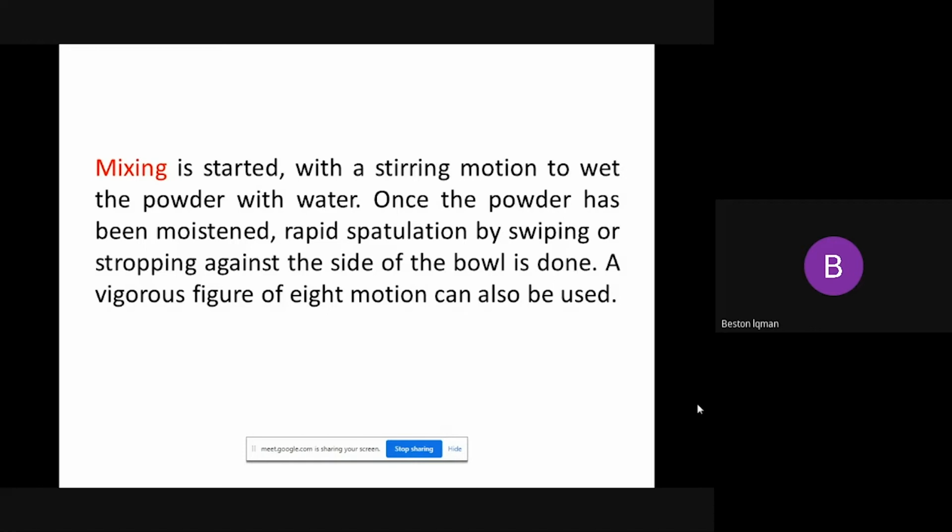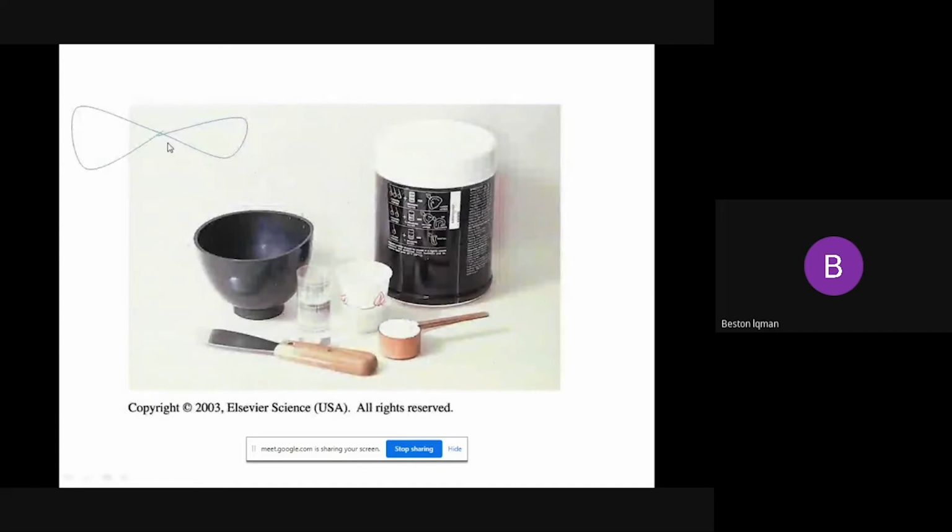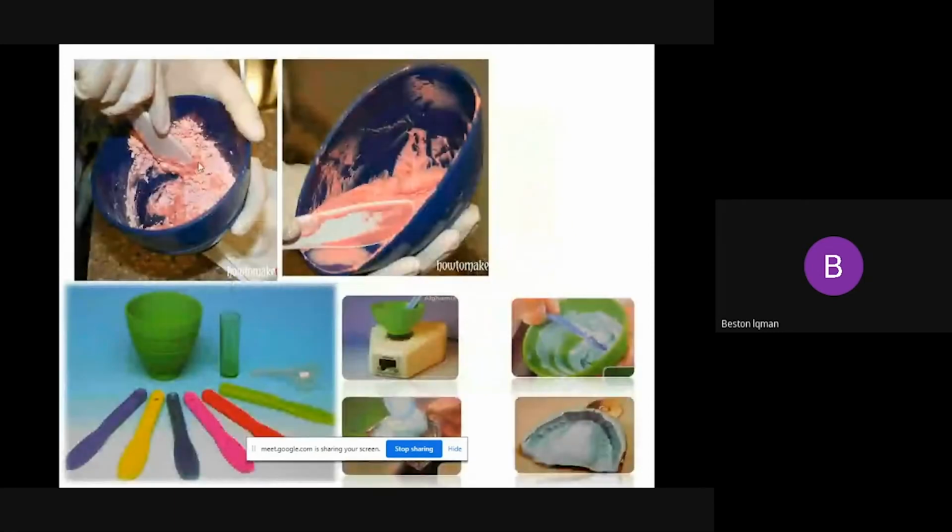Figure of 8, intraorally also, mixing like this. This is the can. Before starting, you must shake it in order to distribute all of the particles. After that, put a scoop of powder. Insert the water, after that insert the powder. After that, mix with the aid of the spatula by figure of 8. Till here it is clear. Like this, figure of 8. Mixing like this.